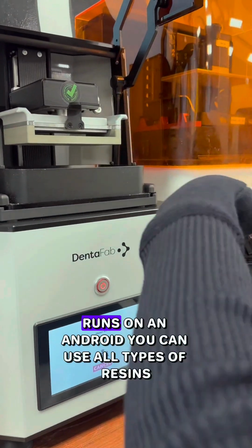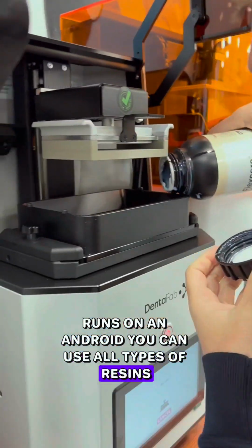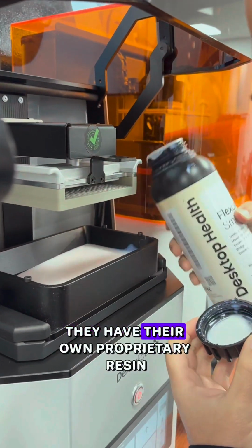It's a nice, cute little printer. It runs on an Android. You can use all types of resins. In this one, I wanted to use Flexera Ultra. They have their own proprietary resin.